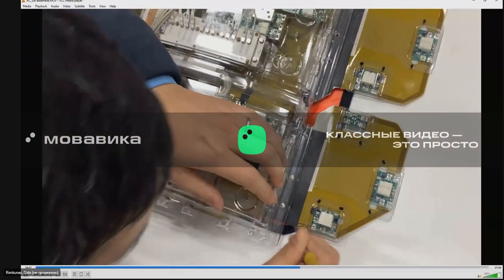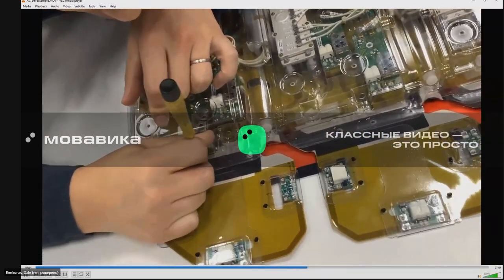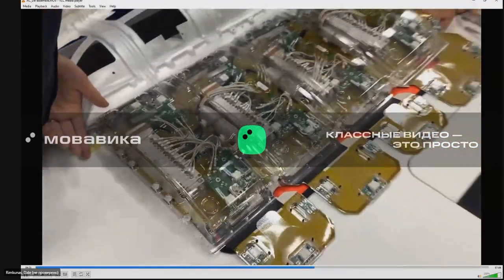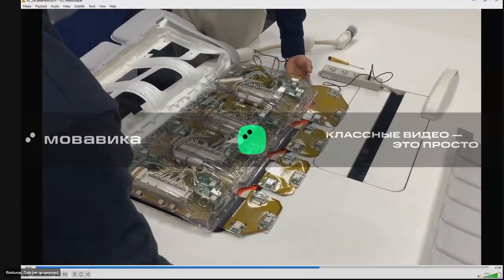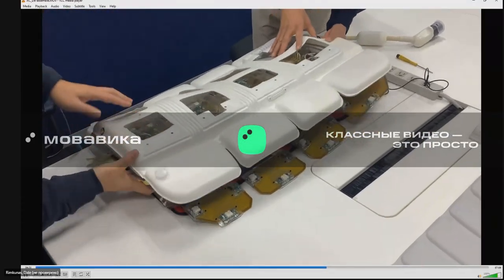I find that once you get good with this, it's about 20 minutes to open the coil and another 20 minutes to put it back together after you've worked on it. And you continue all the way. All the way, but this time I already did 6 of them. And now you're also going to flip it again.